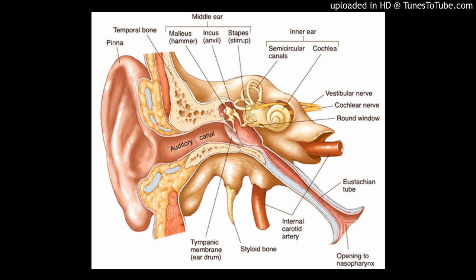Preservation of the ear canal wall. If poorly performed, it may result in a high rate of both residual and recurrent cholesteatoma. Reconstruction of the chain of hearing bones. Clearly, preservation and restoration of ear function at the same time as total removal of cholesteatoma requires a high level of surgical expertise.